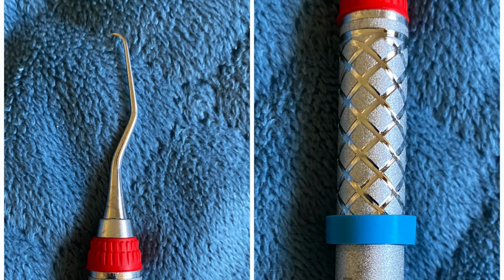Next, I'll be demonstrating the Micro Mini 1-2. This can be used on anteriors, but is also really good for furcations.